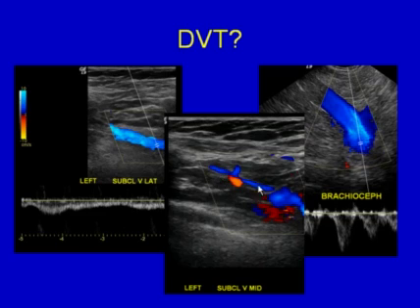Notice that there's a collateral already forming alongside, and then in the more distal vessel you can see this more monophasic waveform. If this were emptying better via a collateral, this may not show that monophasic waveform, and it might actually be fairly pulsatile.